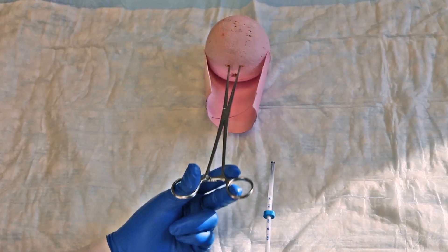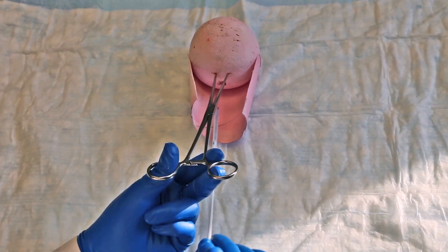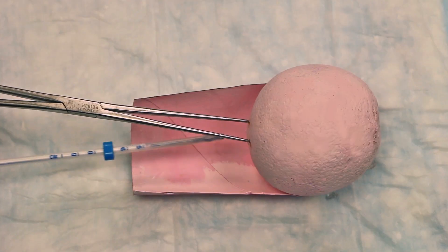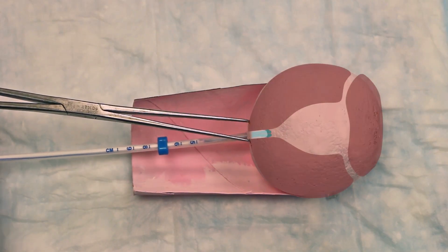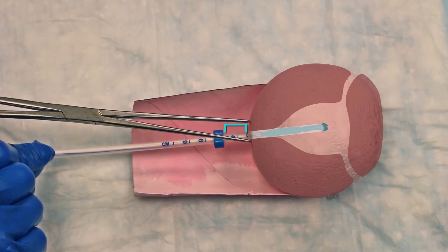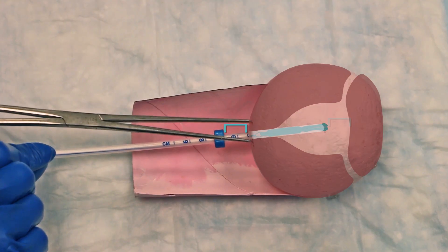Gently align the cervical canal again with the tenaculum, then slide the loaded IUD through the cervical canal. Stop when the upper end of the flange is 1.5 to 2 cm away from the cervix. This will leave enough room at the fundus for the IUD arms to open in the next step. Do not advance the flange to the cervix.